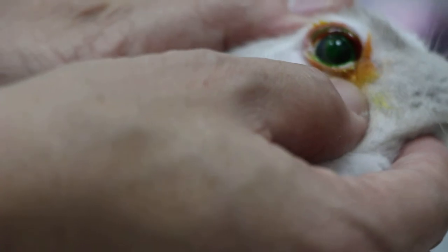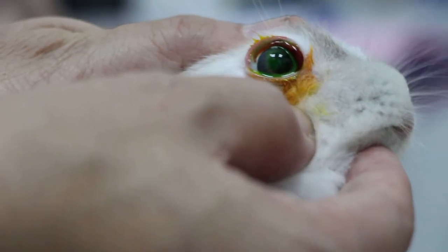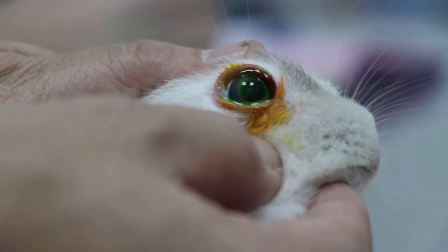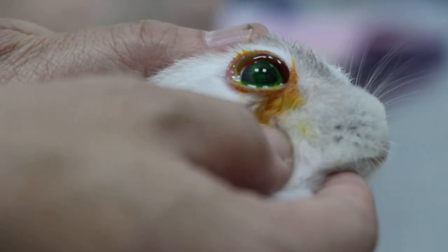The green part is the affected area. In fact, you can see that it's more — actually they are not see-through. You can see it, actually.